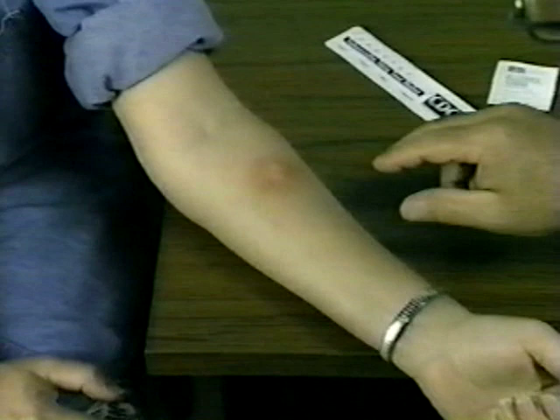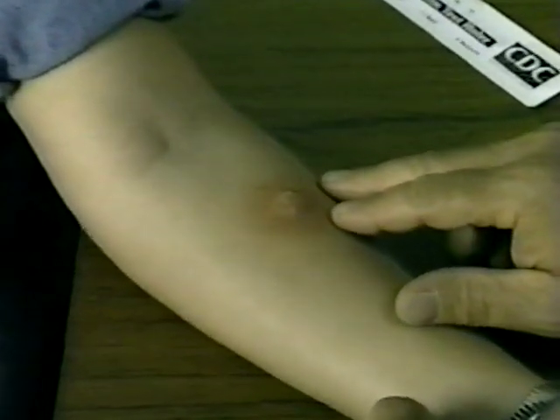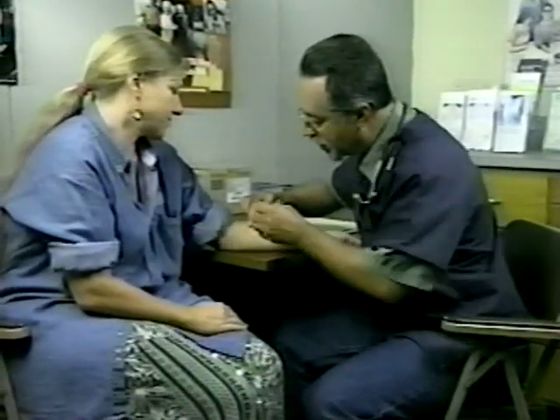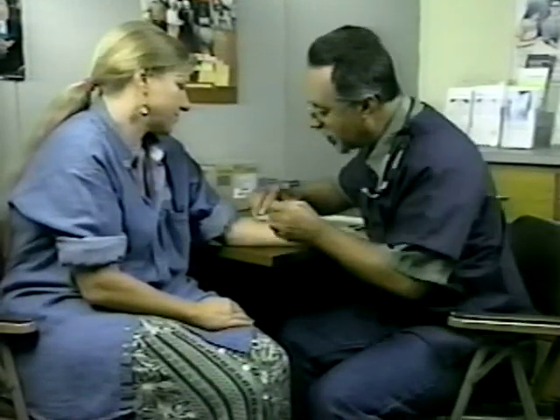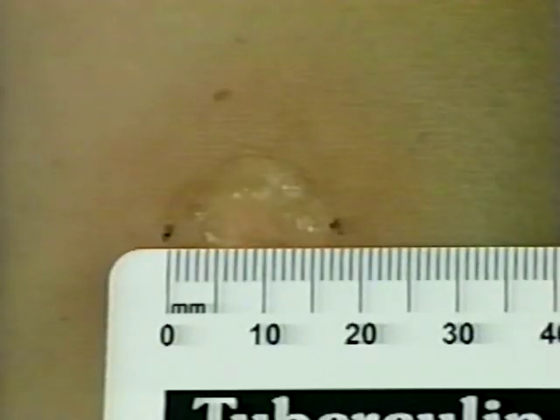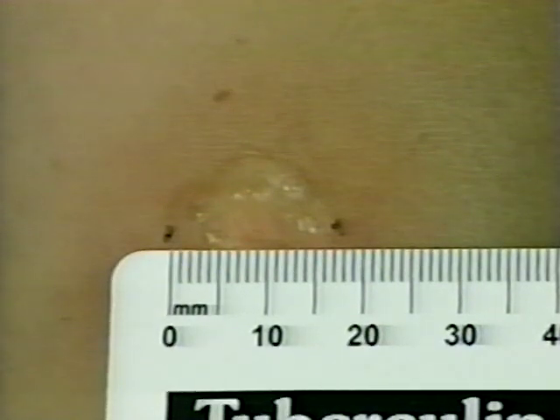Reactions to the skin test will vary. For example, this is a very large reaction with blistering, swelling, and redness. Make sure to record blistering even if no induration is present. Palpate this induration gently, as it may be painful. Measure only the induration — this reaction measures 17 millimeters.